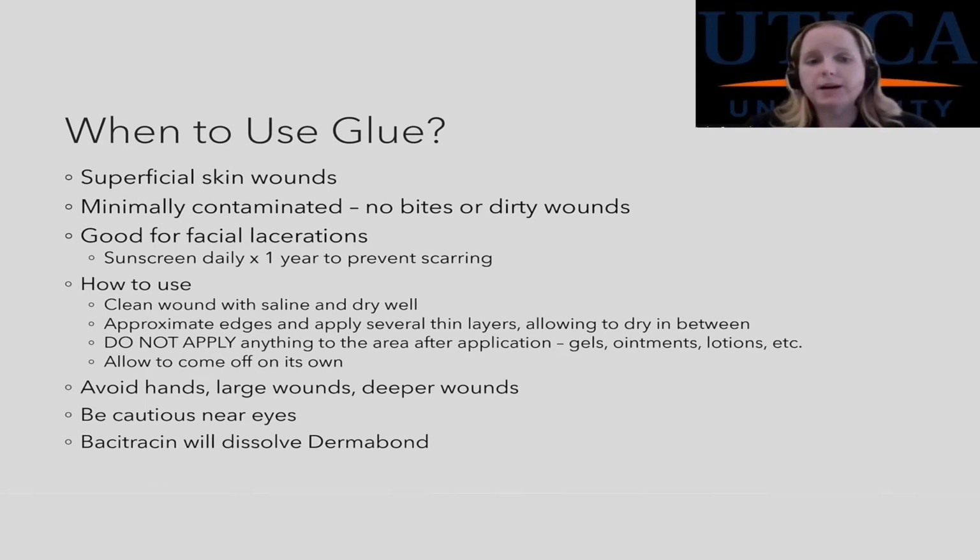If you do get it in someone's eye, bacitracin will dissolve Dermabond. There is bacitracin eye ointment, but you need to be very cautious. Normally what I do is if I am applying Dermabond near someone's eye, I will put a piece of gauze like this over the eye, and then I will Dermabond the area. Just that way the Dermabond will get on the gauze before it gets into someone's eye.